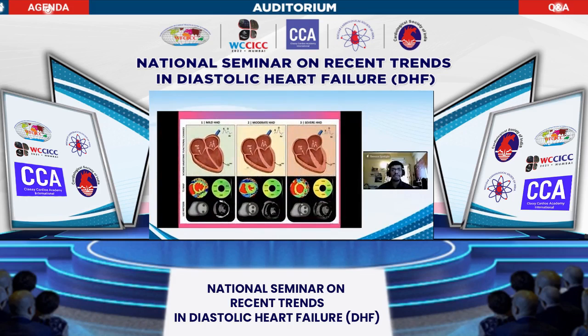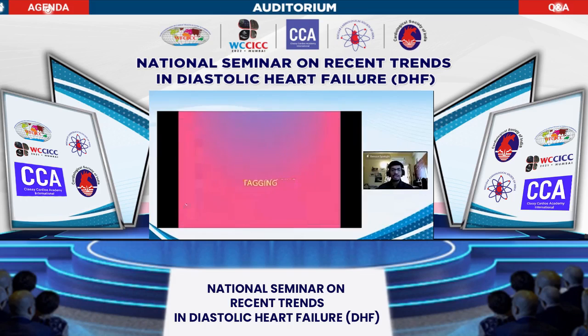And if you look at this patient who progresses from mild to severe heart failure, you can clearly see here that the T1 values are near normal, they keep increasing, and then there is a very high increase in the patient with severe heart disease. And the late gadolinium enhancement is free of gadolinium in the mild, starts appearing in moderate, and then there's significant. So the gadolinium and the T1 sort of go hand in hand.